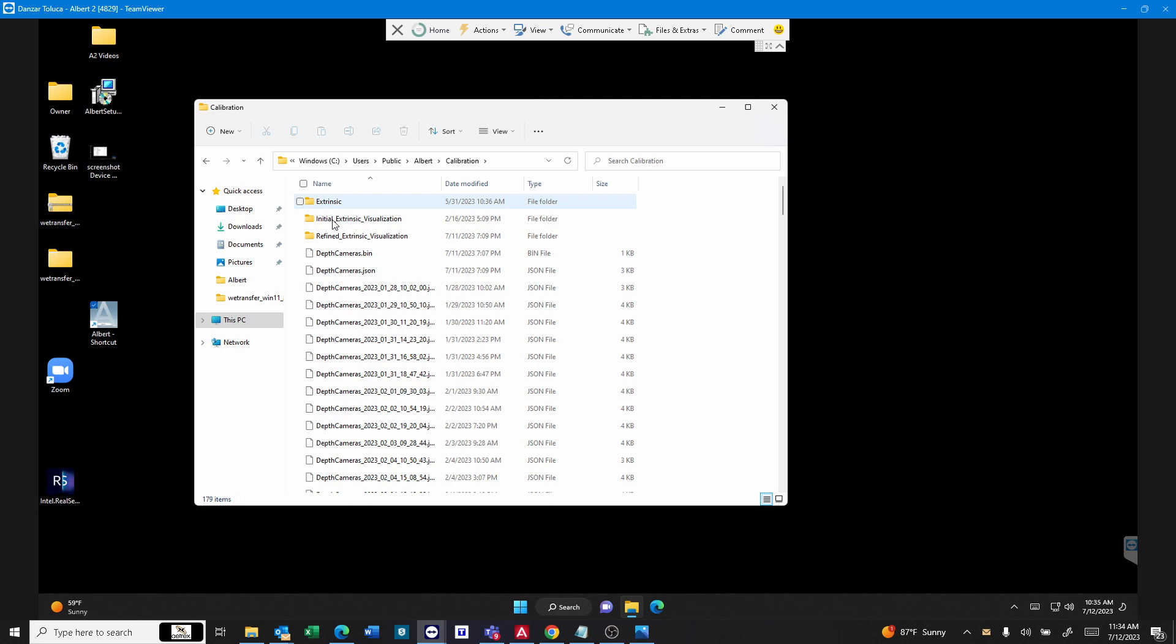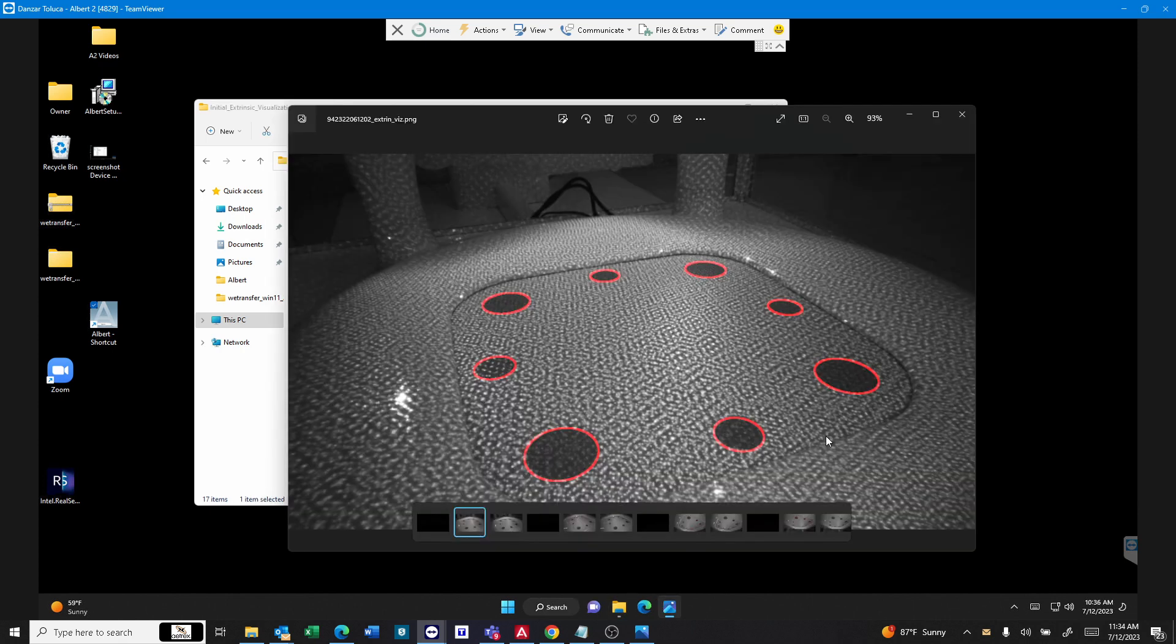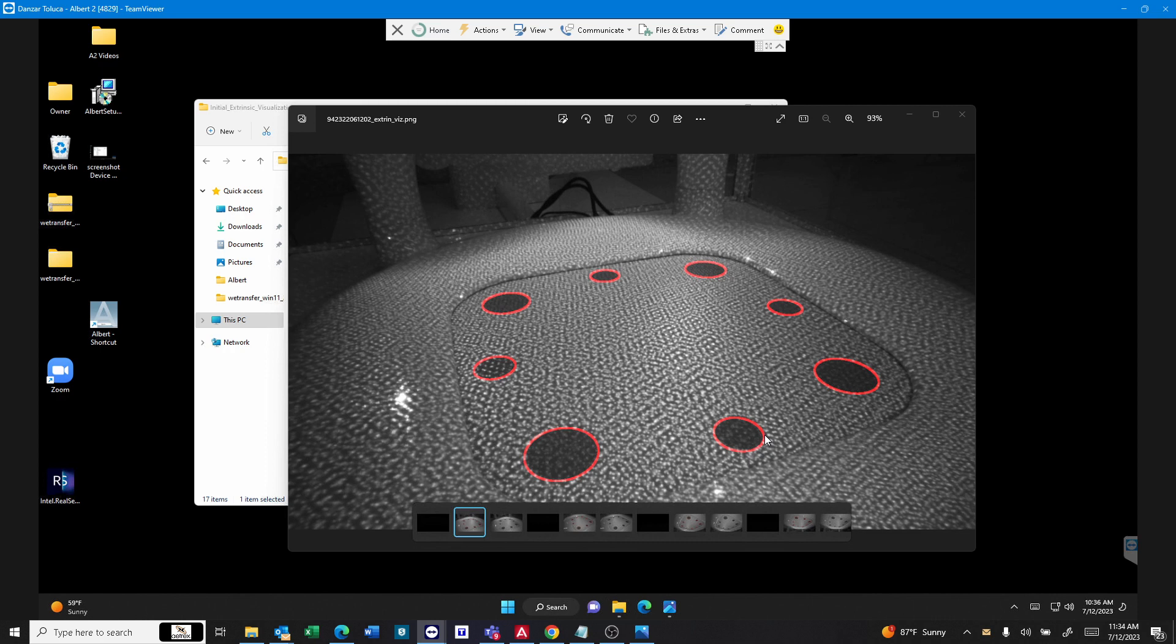The point is, you want your customer to have their feet within this boundary with a little space in between, so that way the cameras can get a visual and a measurement all the way around the foot. If you're standing past this boundary, you're going to get that error.